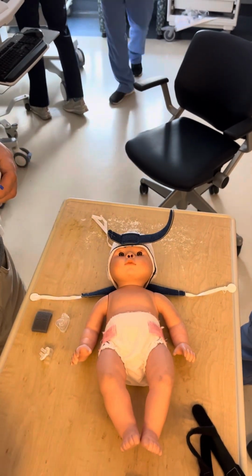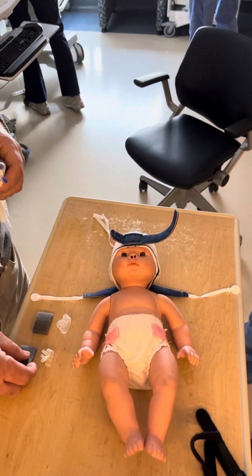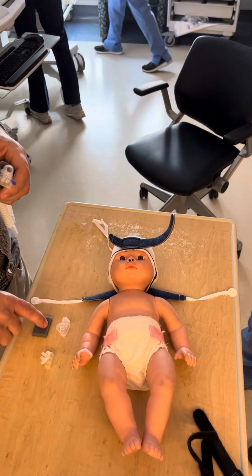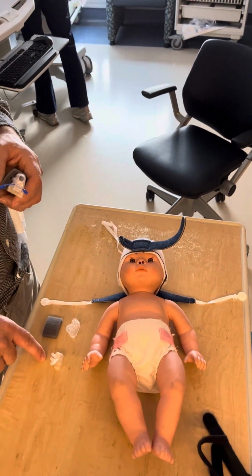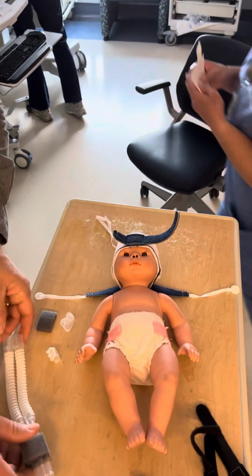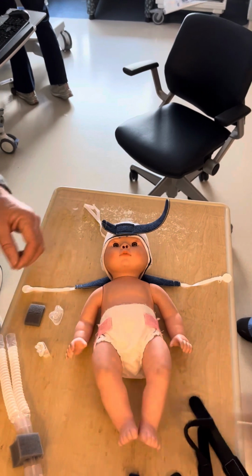So quick quiz: if we have a baby with a coned head and the mask, they have two. If they have a coned head and the prongs, they have one. If they don't have a coned head and they're on the mask, they have one. And no coned head and on the prongs, they have zero. I'm learning something new. I actually never used any of the sponge with the, yeah, but it's good to know.